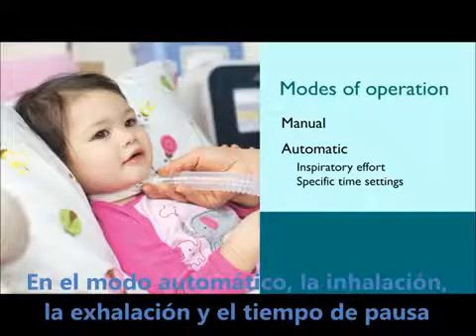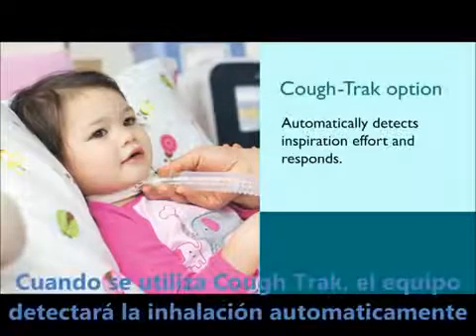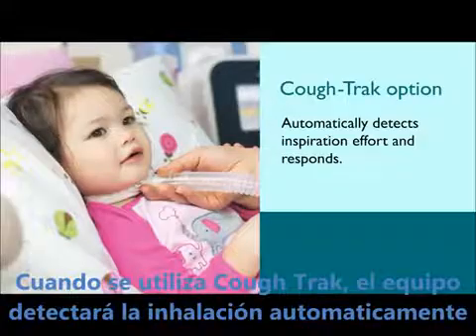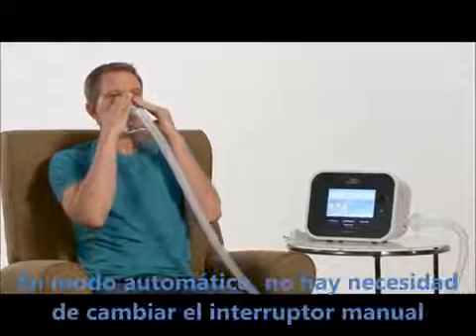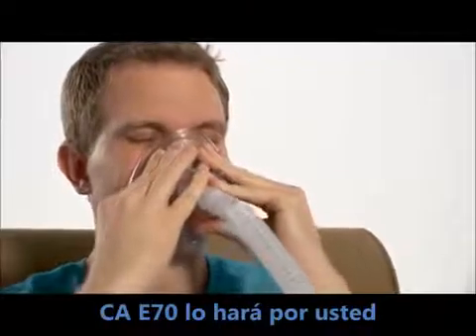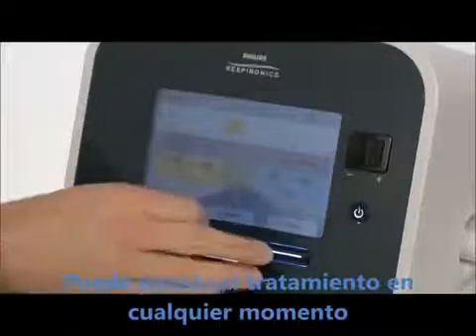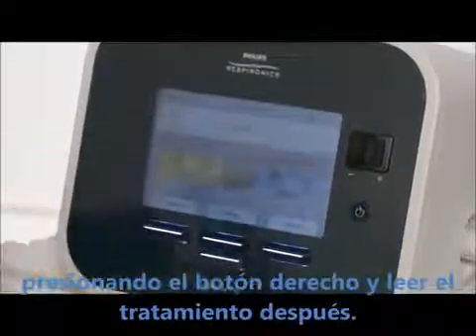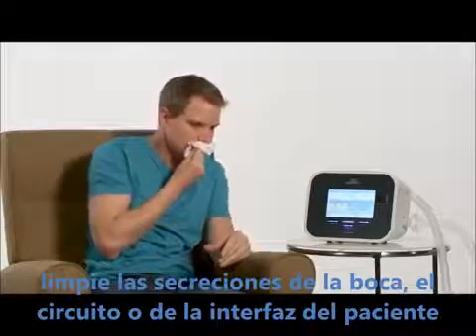In automatic mode, inhale, exhale, and pause times are controlled by the time settings entered. When using the cough track option, the device will automatically detect inspiration effort and respond with an inhalation. With automatic operation, there is no need to toggle the manual switch between inspiration, exhalation, and pause — CoughAssist T70 will do it for you and display the pressures in real time. The patient should still actively inhale and exhale. You can pause the treatment at any time by pressing the right button under standby. After the treatment, clear any secretions from the patient's mouth, tubing, and patient interface.